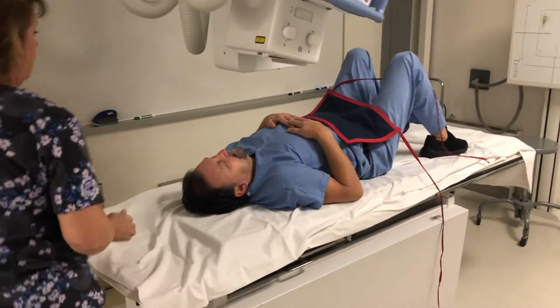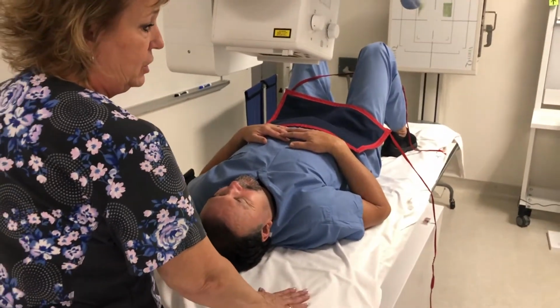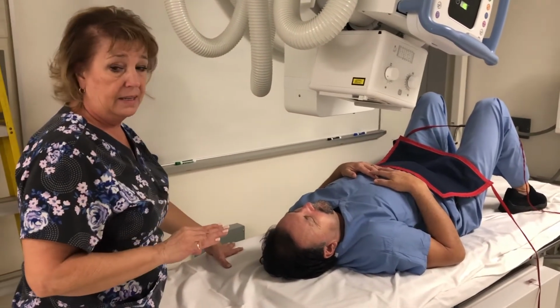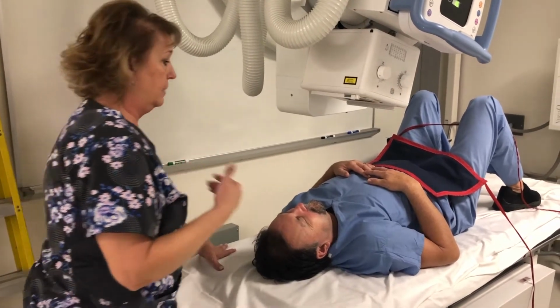And you'll notice that for the last two, this projection and the one I just did, the open mouth, he doesn't have a pillow. That creates density, and so for your cervical x-rays, you have to remember to take the pillow out.